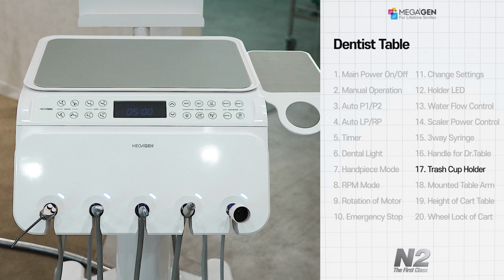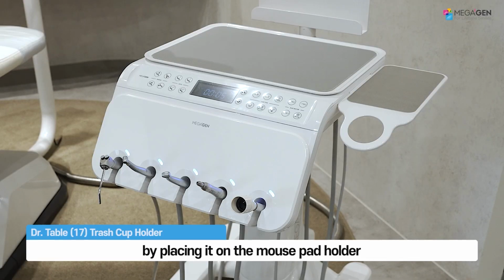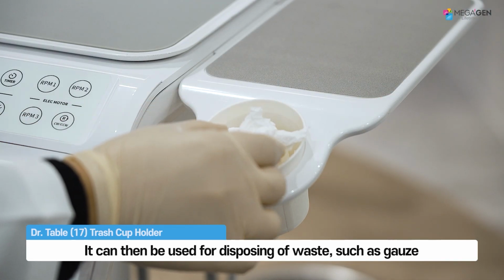Trash cup holder. The trash cup holder allows the used cup to be reused by placing it on the mousepad holder. It can then be used for disposing of waste, such as gauze.